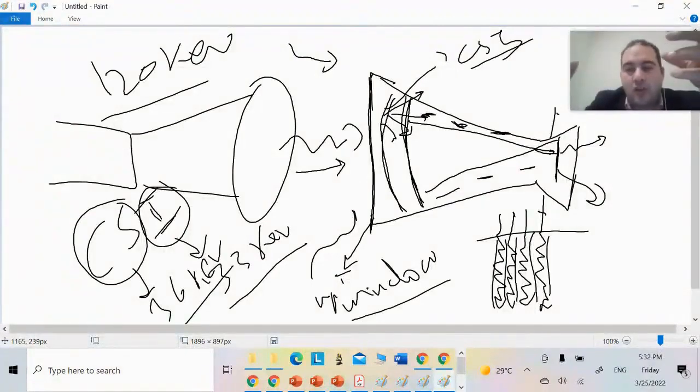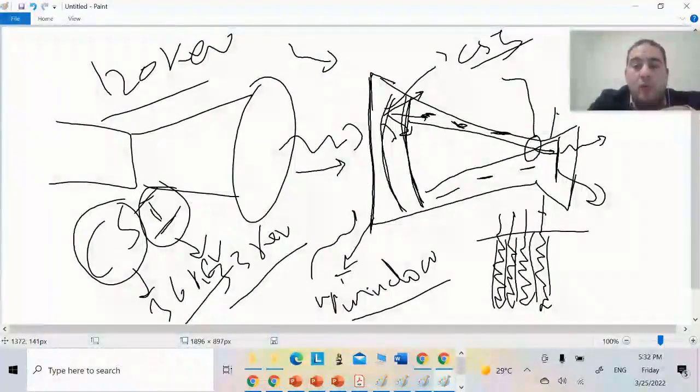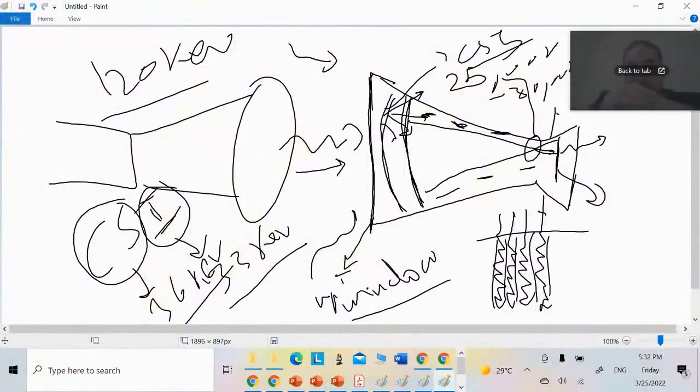What is the kinetic energy for? It's for the electrons to move with it. They undergo excitation and move with it. At the same time, I will place an anode here. This anode has a voltage difference between it and the cathode that ranges from 25,000 volts to 30,000 volts, which is very high and powerful. What does this do? It makes all the electrons go towards the anode and gather, and they get focused.